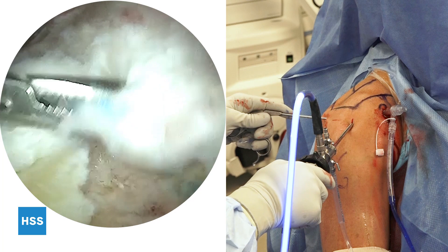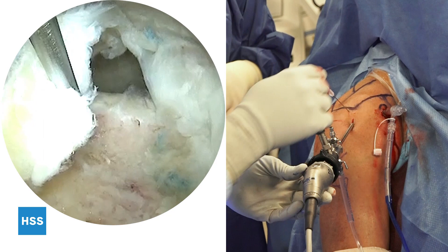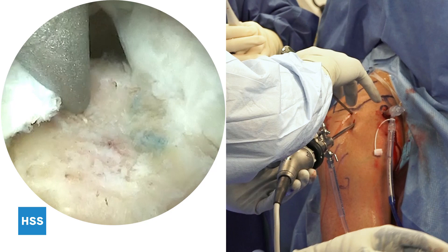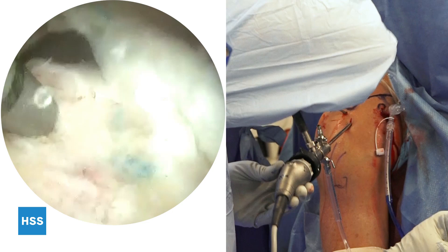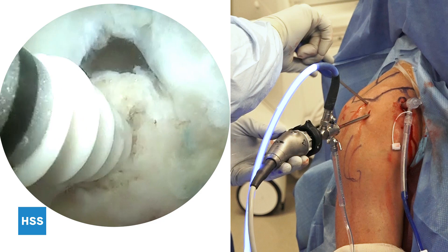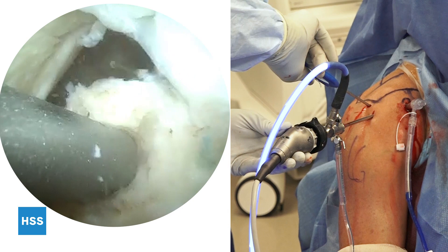Now I'm going to place the anchor. This is the medial row anchor, placed through a percutaneous puncture on the lateral aspect of the acromion. This allows a proper trajectory at the so-called dead man's angle. It also allows for suture management as we proceed with the repair. Viewing through the anterolateral portal gives excellent visualization of where this anchor is placed relative to the articular surface and footprint. This gentleman's bone is relatively hard, so after the awl is used, the tap is used and then the anchor is placed. This is a triple-loaded anchor. Care is taken to ensure it is by the subchondral bone but does not violate the articular surface.